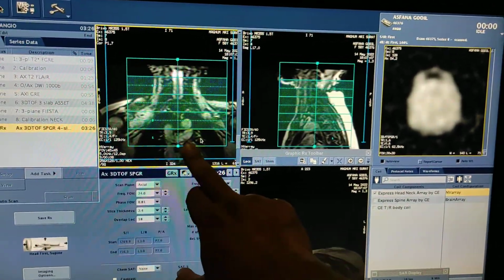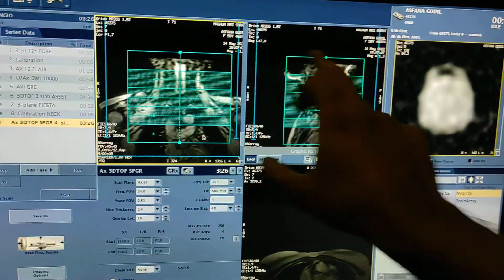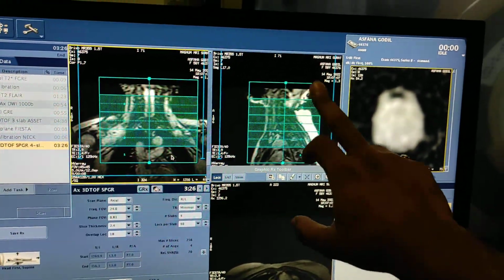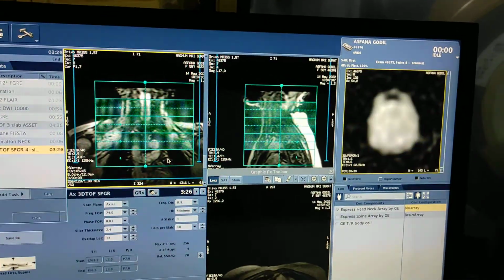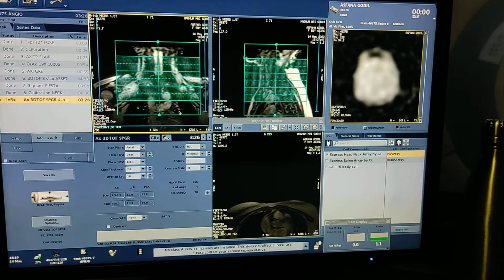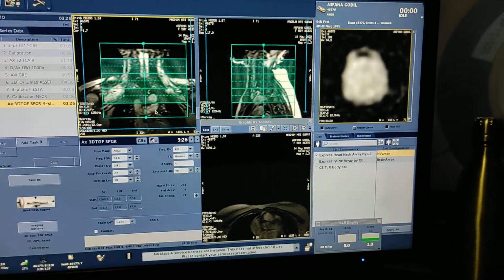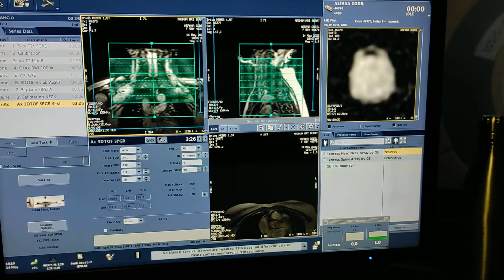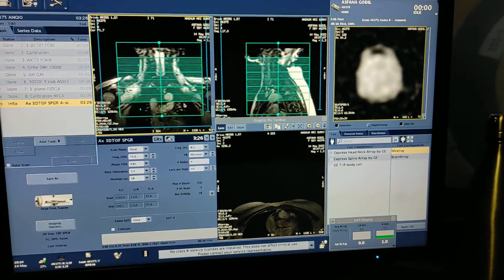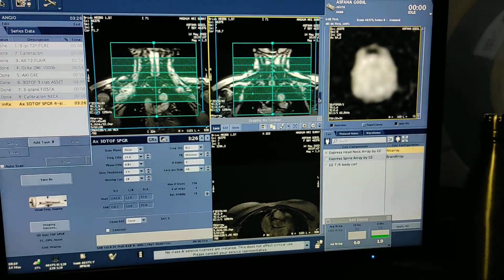You have to cover from arch of aorta to CV junction. Overlap a few images, because we started the circle of Willis from CV junction to corpus callosum. So you have to overlap a few images. While doing the reporting, the consultant will correlate both the images, so nothing should be missed. So this is the exact planning for neck vessels angiogram.